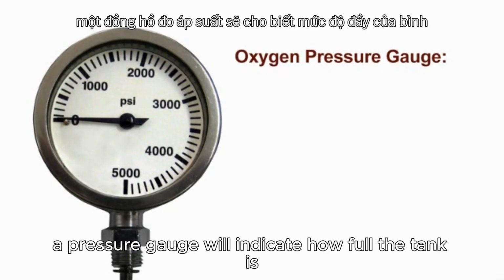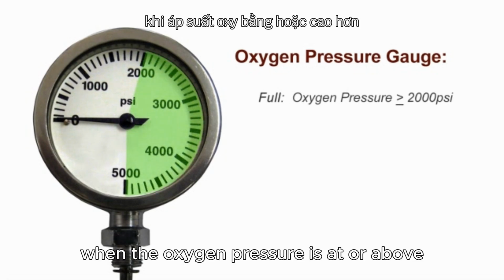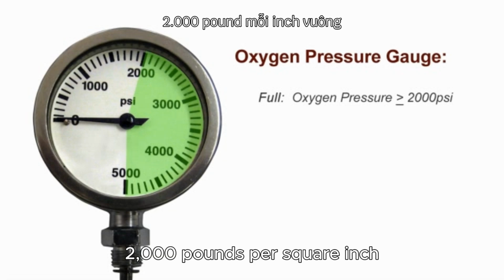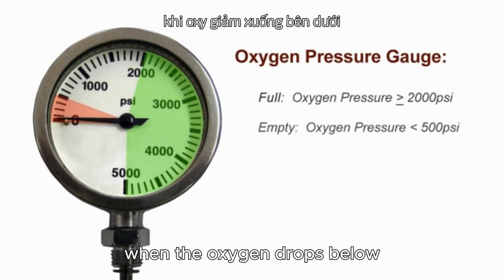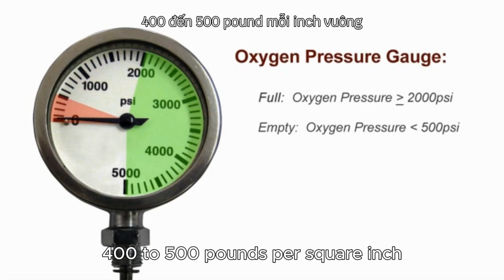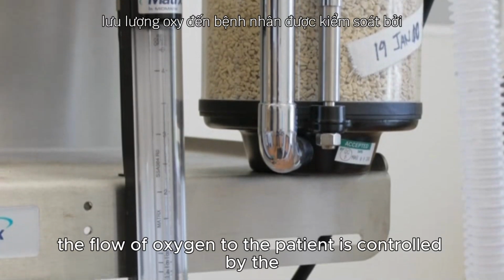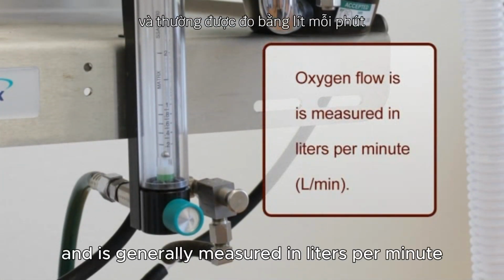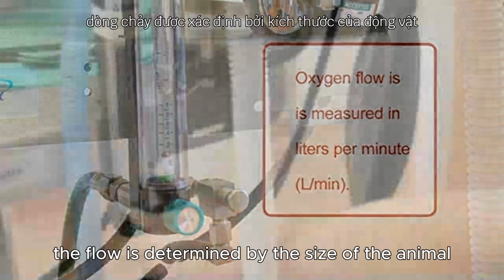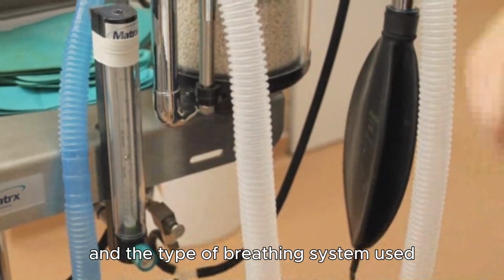A pressure gauge will indicate how full the tank is. When the oxygen pressure is at or above 2,000 pounds per square inch, the tank is considered full. When the oxygen drops below 400 to 500 pounds per square inch, it's time to switch tanks. The flow of oxygen to the patient is controlled by the oxygen flow meter and is generally measured in liters per minute. The flow is determined by the size of the animal and the type of breathing system used.